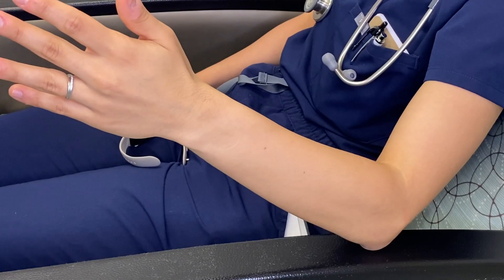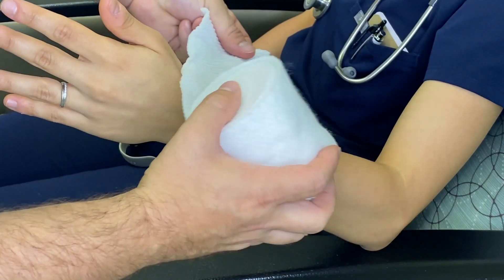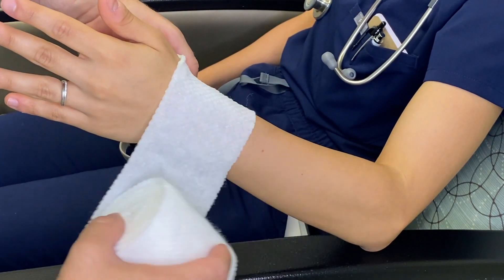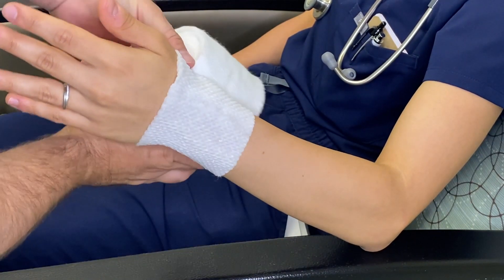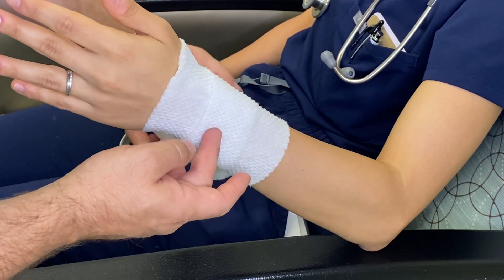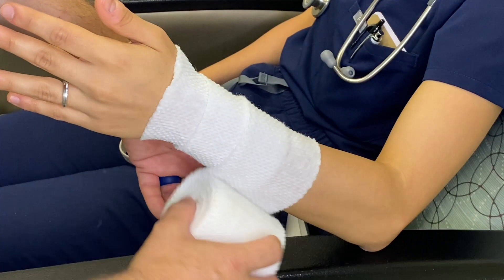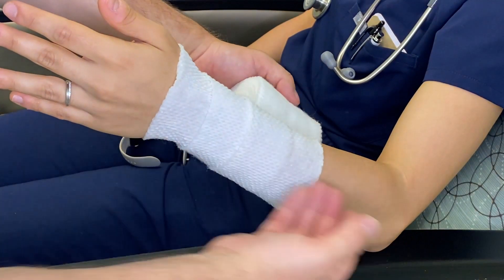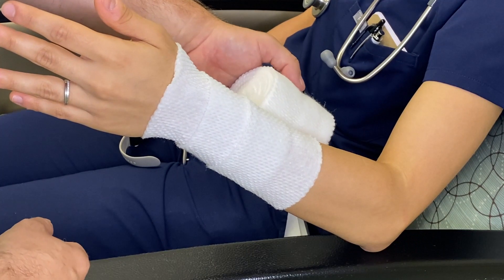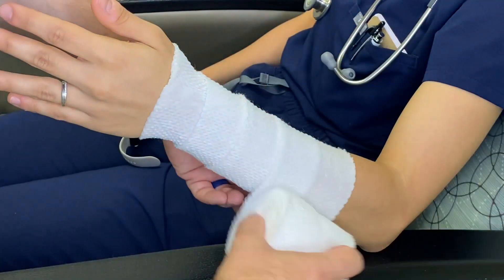As you see me rolling the web roll, I use a method I call rolling out, not in. When you roll in you tend to fight the material as you're rolling around the patient's arm. When you use the roll out method you're allowing the material to flow freely through your hand. You can use this in the application of fiberglass, cotton, web roll, ace wrap, curalex, clean wrap, and even coban.